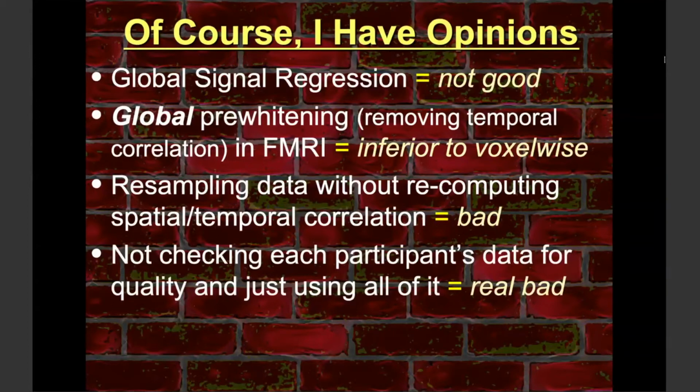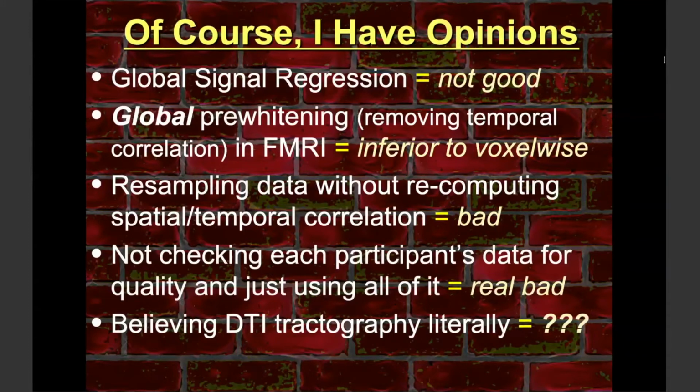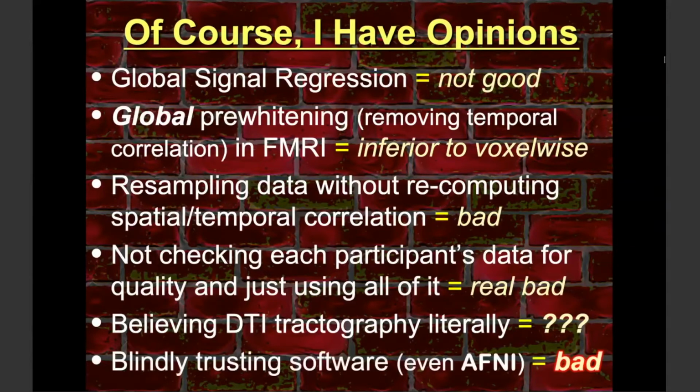These are my opinions, remember. Believing DTI tractography literally. Well, DTI tractography is pretty interesting, but is it bad or good? I don't know. I'm puzzled by this because it isn't really literally true, but it has some correspondence with reality. But people should understand the limitations. And blindly trusting software, even AFNI, is bad. That's got red stuff around it to indicate that's actually pretty damn bad.